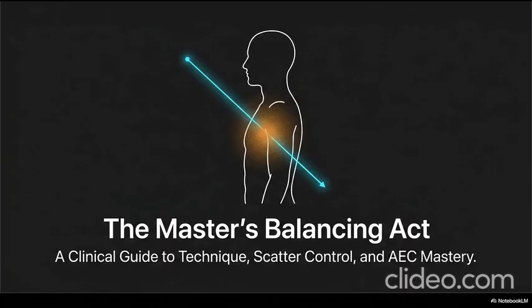Because when you increase the milliamperage, you are physically heating up a tungsten filament inside the cathode of the X-ray tube. Which causes a process called thermionic emission. You are literally boiling electrons off that filament. Boiling them off. Yeah. The hotter the filament gets, the more electrons boil off into a cloud. Then, those electrons are hurled across the vacuum tube to smash into the anode target, and that high-speed collision creates the X-ray photons. So if you turn up the mAs, you boil off more electrons, and you get a larger sheer volume of photons. Right.